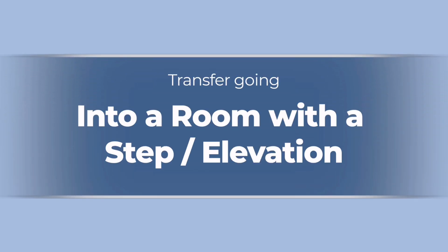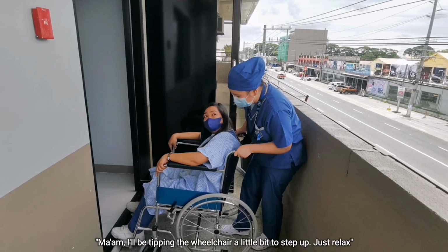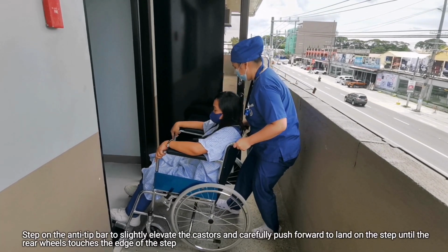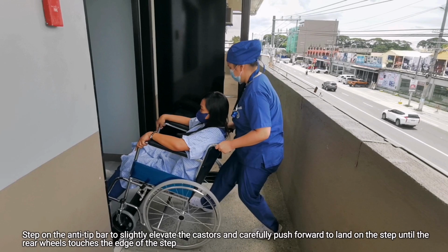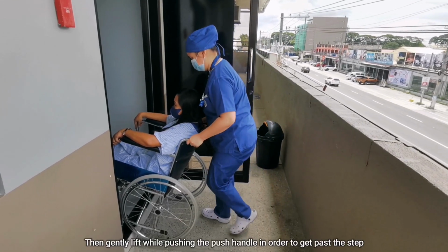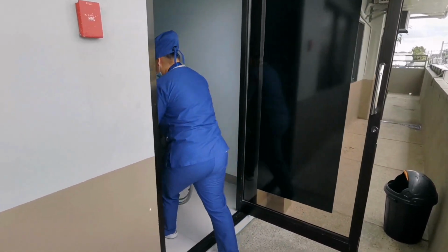Transfer going into a room with a step or elevation. Let your patient know what you are going to do. Ma'am, I'll be tipping the wheelchair a little bit to step up. Just relax. Step on the anti-tip bar to slightly elevate the castors and carefully push forward to land on the step until the rear wheels touch the edge of the step. Then gently lift while pushing the push handle in order to get past the step.